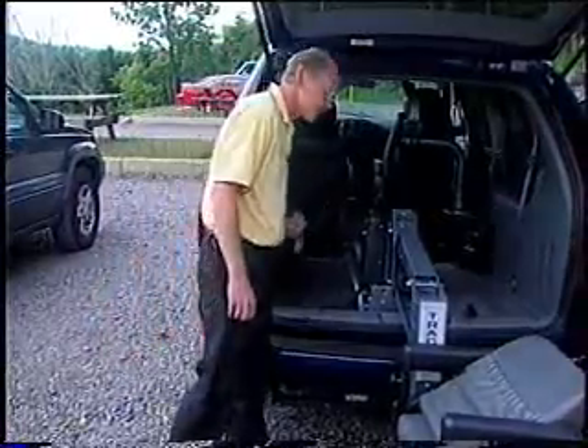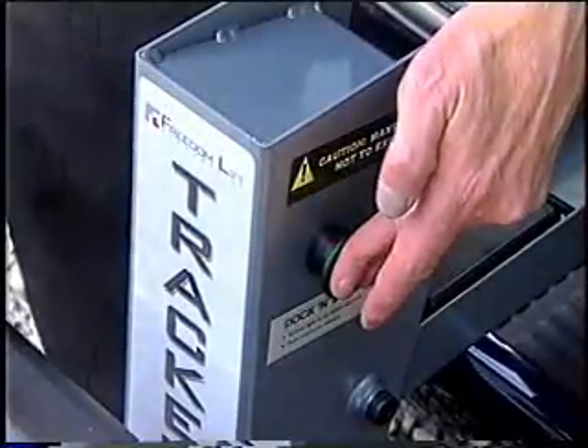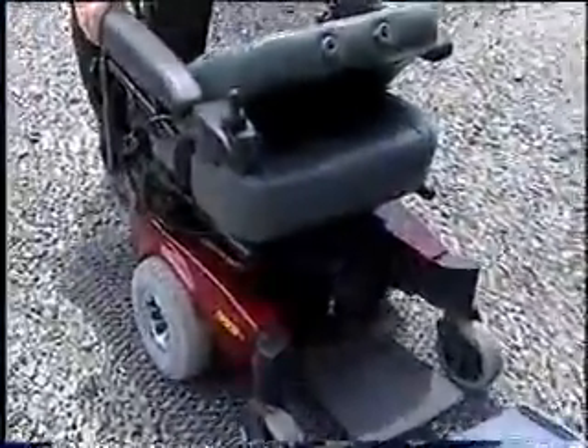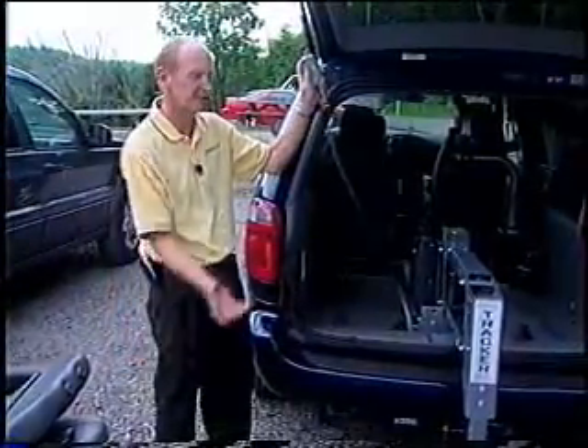The Tracker's self-docking securement system — just push the green button here and the chair comes off the docking lock. Then all the customer has to do is push the end button. It picks it up and takes it back in for them.